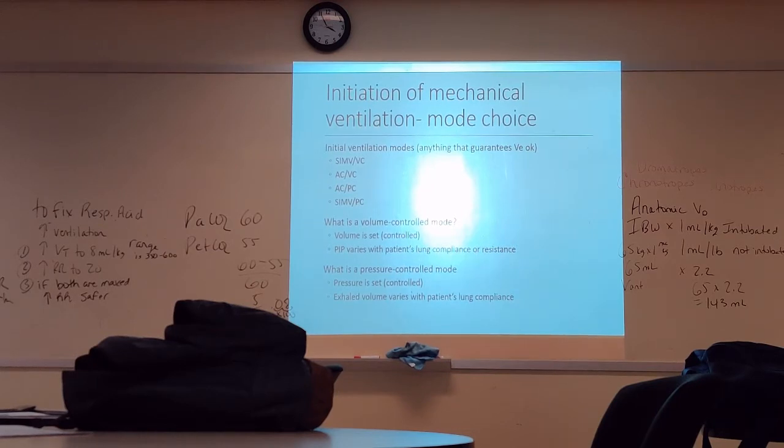So again, when you're picking a mode for the boards, it doesn't make any difference which one you pick. You just have to be able to guarantee a minute ventilation, okay? Now, pressure control situations are always really important when you're thinking about somebody with chest trauma, flail chest, things like that. In a volume control mode, the volume is set and therefore guaranteed, okay? Pressure control mode is the pressure that's set, and so tidal volume will vary. We've already discussed this, but it's here just to review.